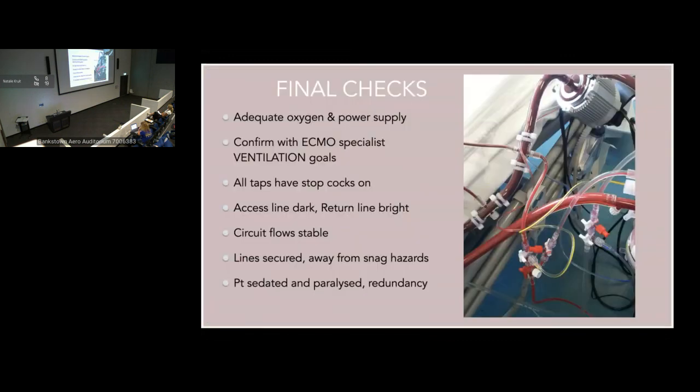So lastly, just before you're departing, you should go through some final checks. You want to make sure that you've got adequate oxygen and power supply. You want to confirm with the ECMO specialist your ventilation goals. You want to make sure that all your taps and stopcocks are really tight. The last thing you want is to have exsanguination in the patient, particularly on a retrieval.